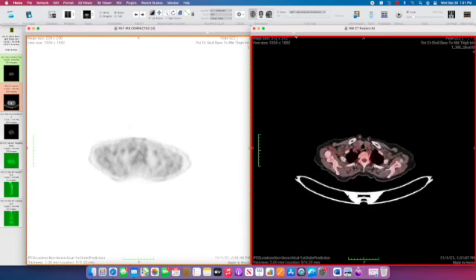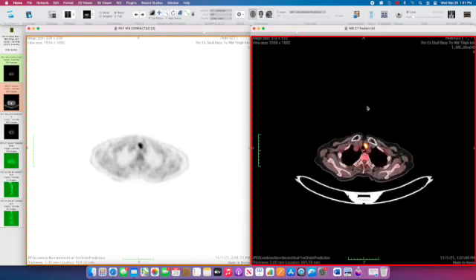But as we come down into the chest we see some abnormal very bright activity or hypermetabolism within some mediastinal lymph nodes here. Left paratracheal.